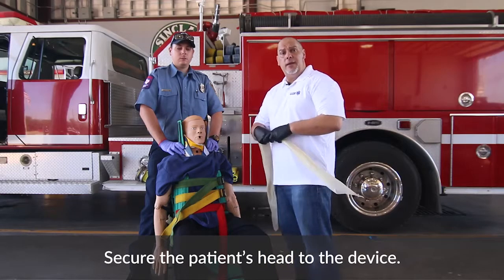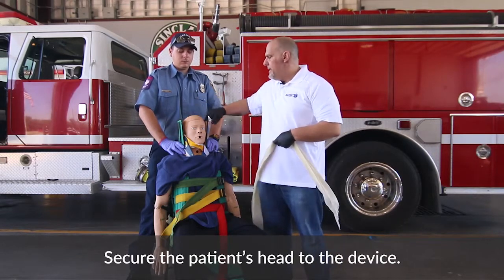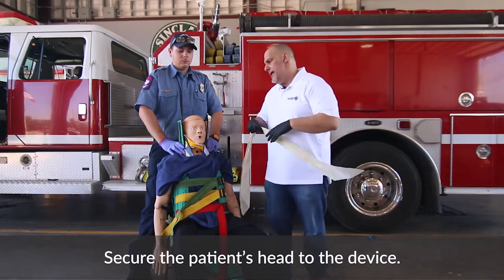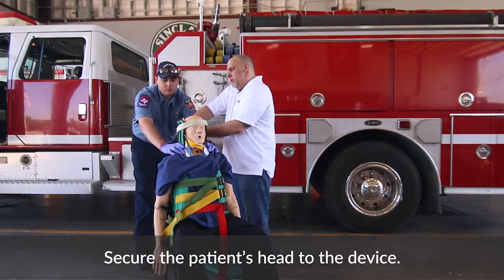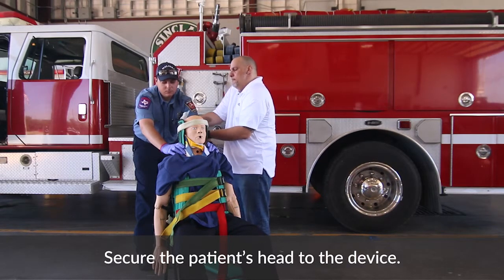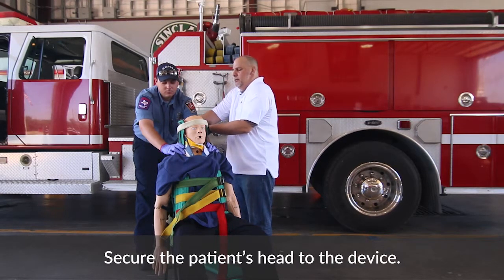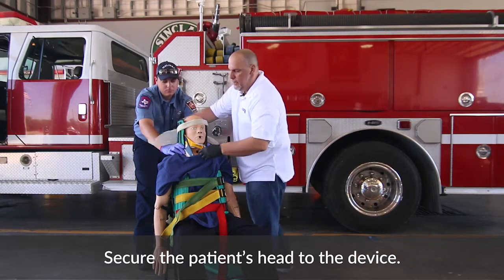The next thing we want to do is secure the head to the device. Some KEDs come with straps that will allow you to do that. If you don't have straps, you could use a triangular bandage as well. Working with your partner to maintain good manual inline stabilization, go ahead and tie this in a knot. Make sure the patient is comfortable at all times. Always verbalize to the patient.